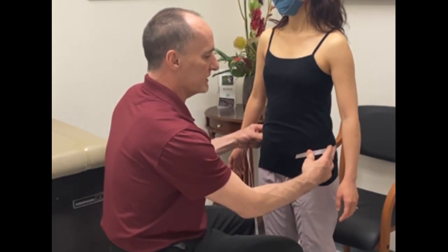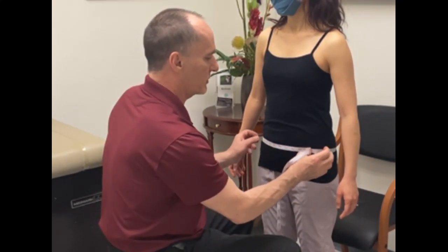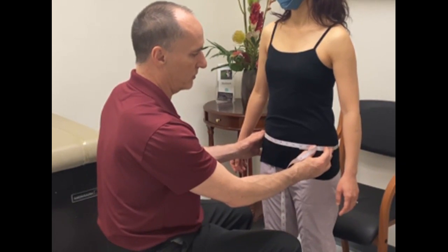Move up to the ASIS and take a circumference measurement there. Same thing again — just a little bit of tension, not too much tension on the tape measure.